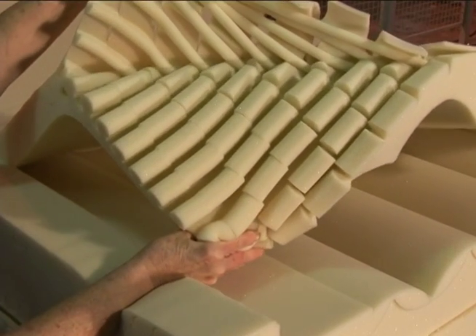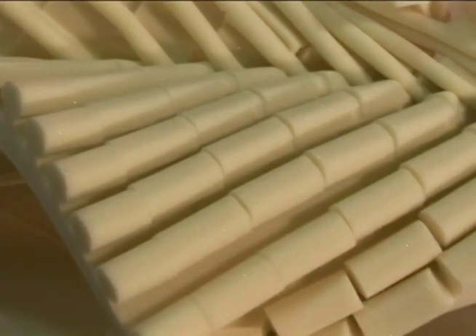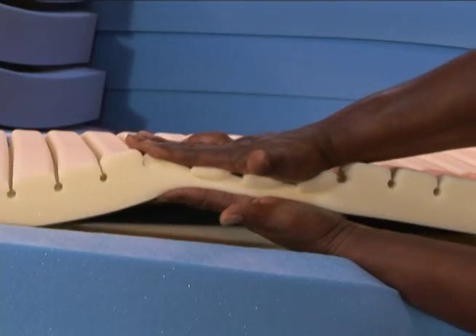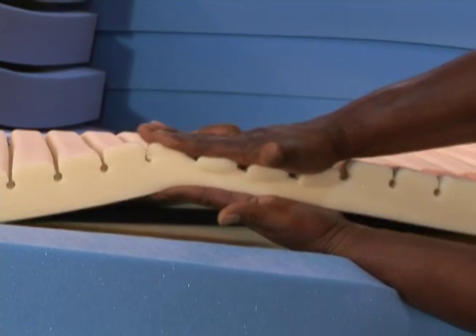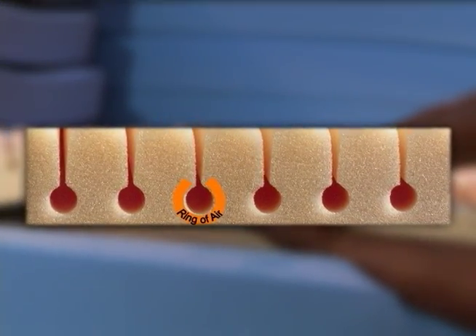SPAN America's solution to shear force trauma begins with the shear reducing GeoMat top layer with over 800 individual pressure redistributing support cells and the ventilating action of the exclusive ring of air design, which reduces heat and moisture buildup on the skin.